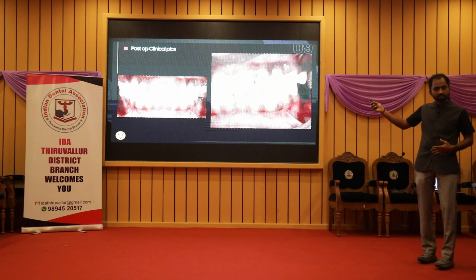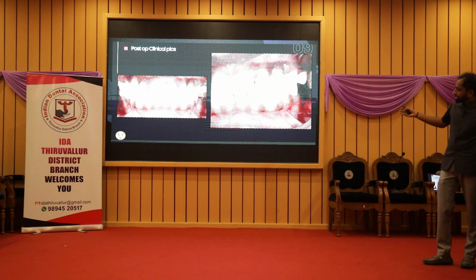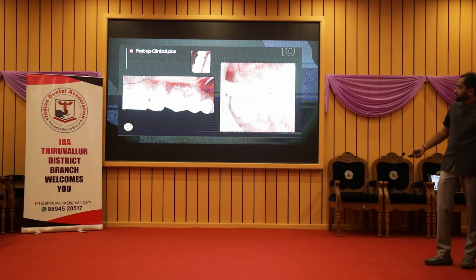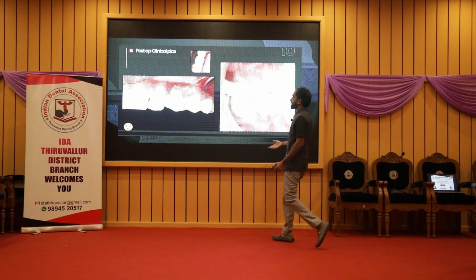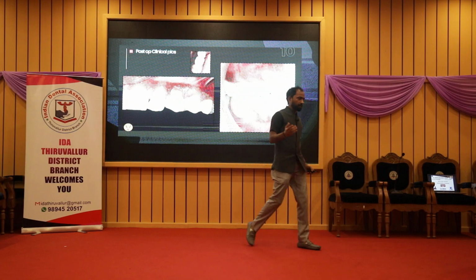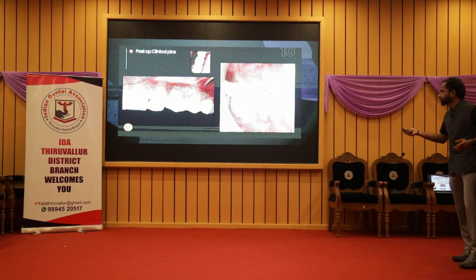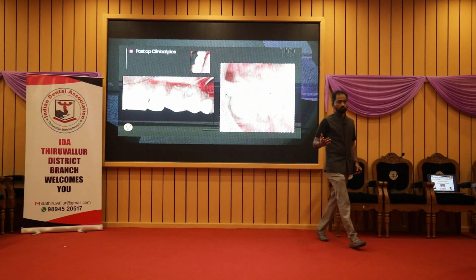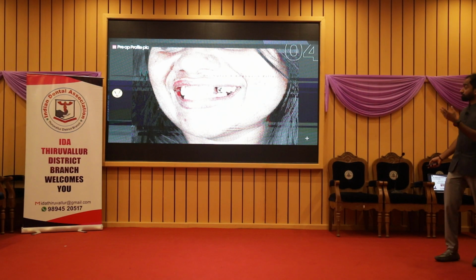I think this is too bright. On the LED screen, laptop it is okay, but it's pretty good aesthetics. Nobody can make out that it is a crown. This premolar is a crown, and you can see that we didn't lose the papillae and we didn't lose the aesthetic zone, I mean the zenith, as well. So we were able to recreate it, and even the molar looks pretty good. So that's a very straightforward case.